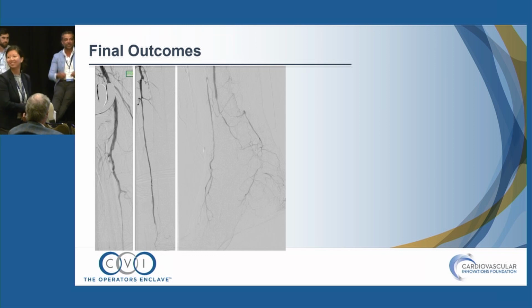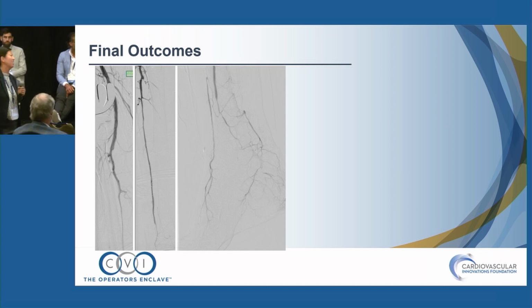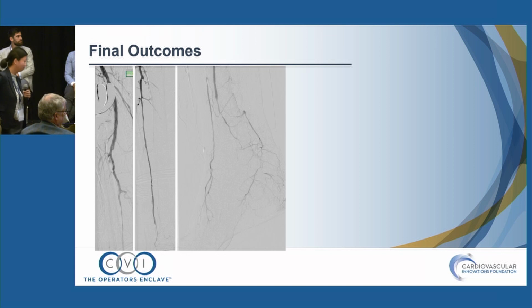But you do the same for AT, DP, PT, you use balloon occlusion for everybody. It's probably most important for peroneal, just because it's non-compressible. If it's a PT or AT, you probably don't need to. But definitely don't reverse the anticoagulation and then go with the balloon, because you'll clot off that artery. And I've had one case that I couldn't cross with the peroneal. The blood pressure cuff is usually fine, because the perfusion pressure is so low, because you didn't open it.